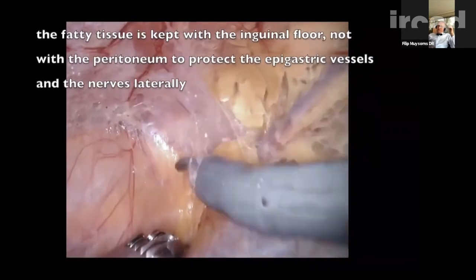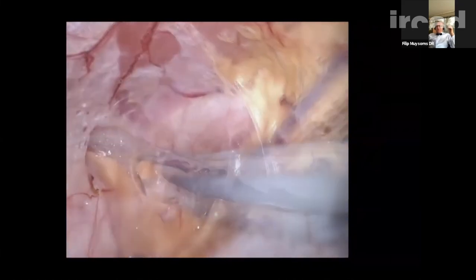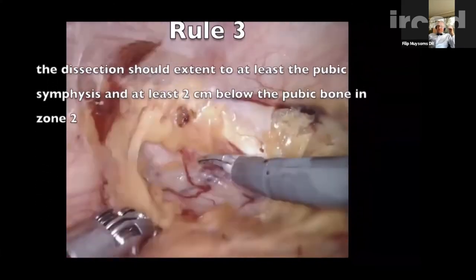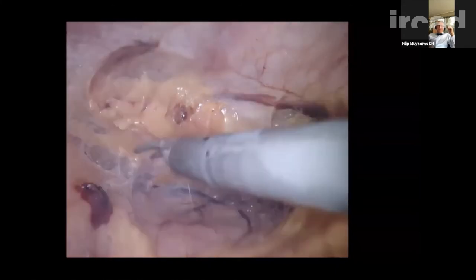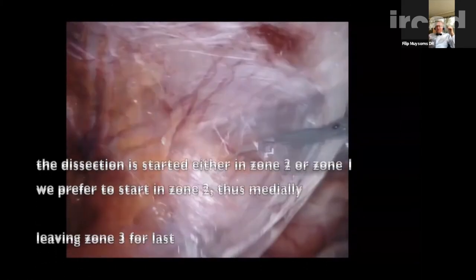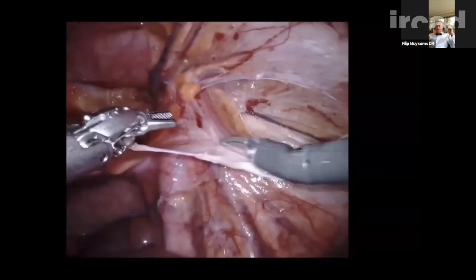The five triangles apply: for lateral hernias, medial hernias, femoral hernias, the triangle of doom, and the triangle of pain — with the three zones as described. Rule 1: incise the peritoneum on top of the inguinal canal about 4 cm above the internal inguinal ring. Rule 2: follow the peritoneal plane and keep fat and fascia with the abdominal wall to protect the epigastric vessels medially and the nerves laterally. Dissection starts medially then proceeds through all steps.